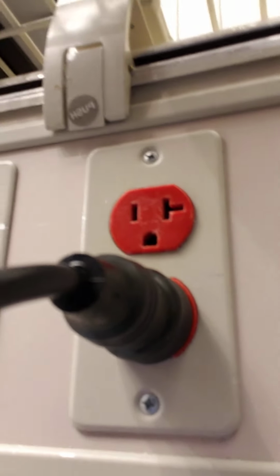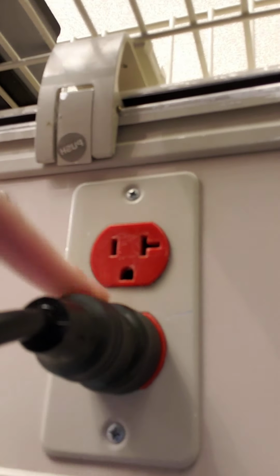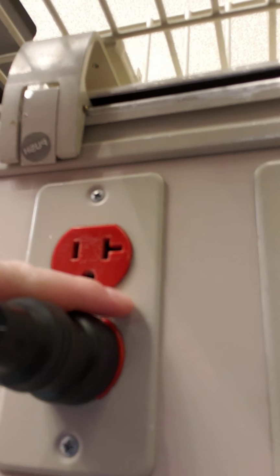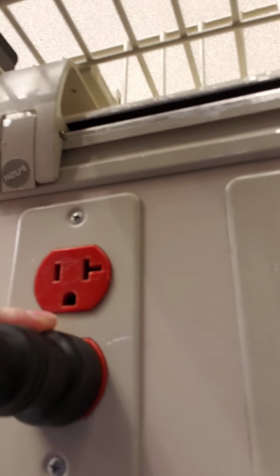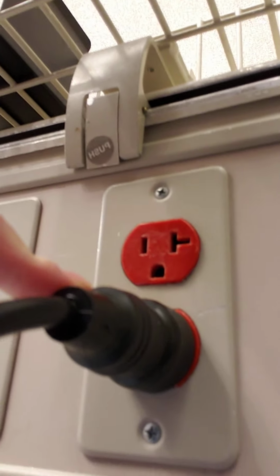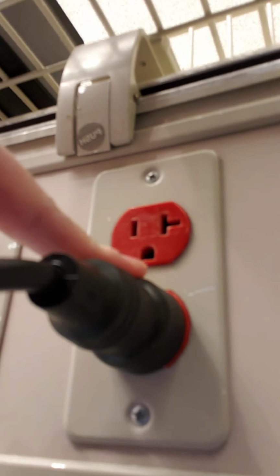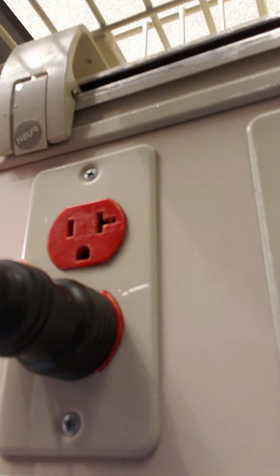The reason we use the red circuit is because this is hooked up to a backup generator that will give continuous electricity without any pause, so that all of our respiratory equipment will get top priority for any electrical situations, such as if the power goes out, which I have had happen. I've had the power go out and backup generators kick in, and I've been very glad for these red outlets.